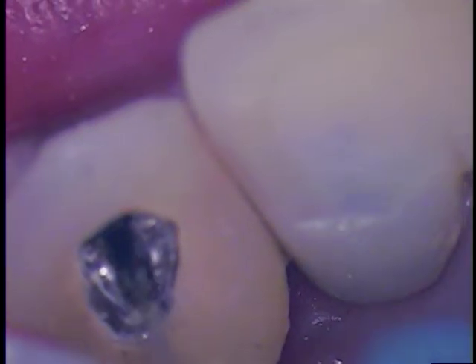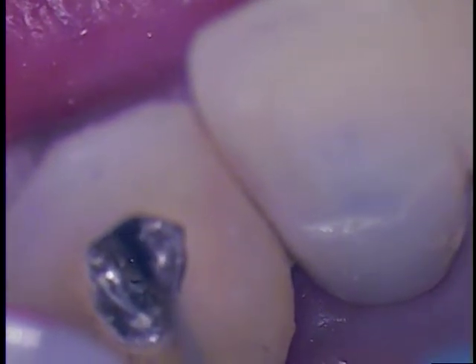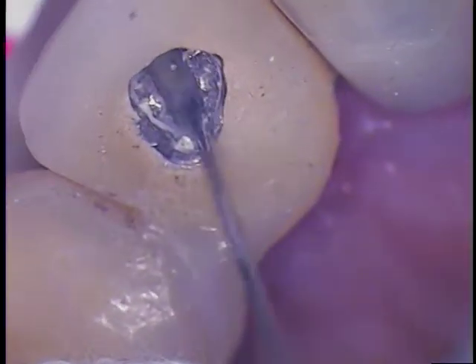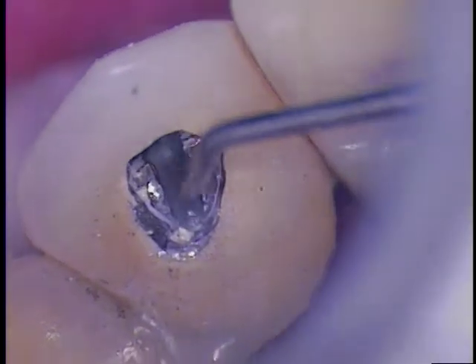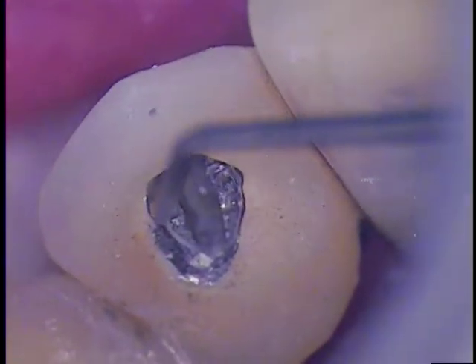Just stay right there. We'll fill up that hole. So I'm agitating it as it's in there. I'm using a small explorer — this little pigtail explorer — and I'm going to agitate it and work it into the seams.